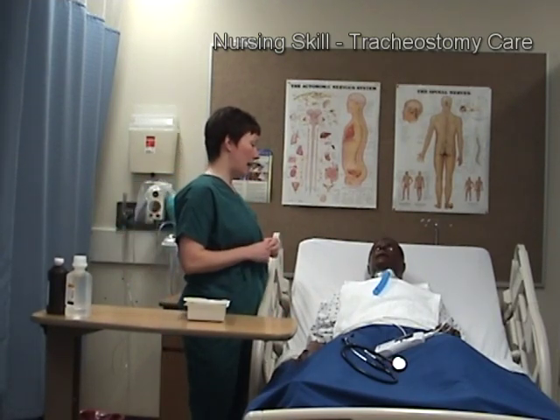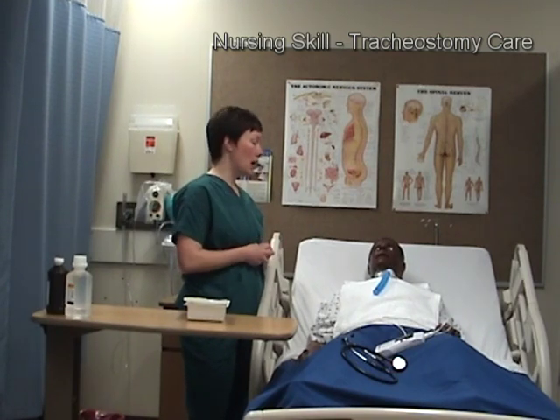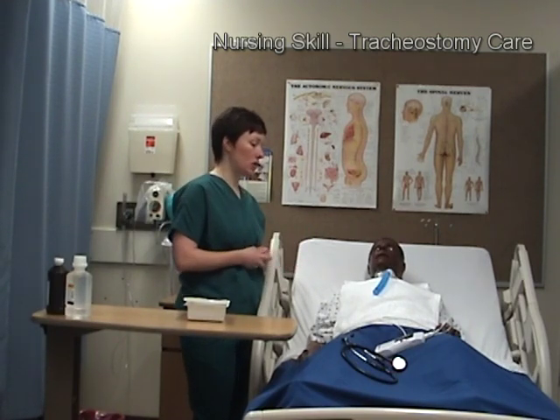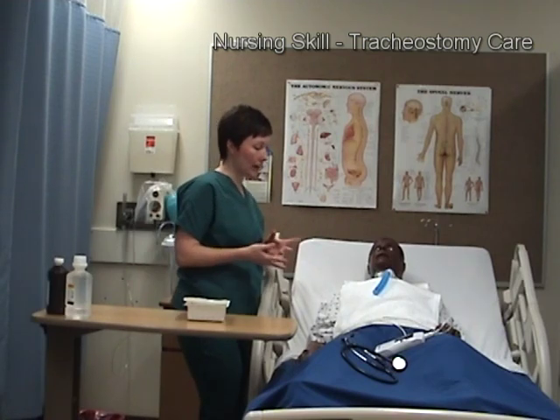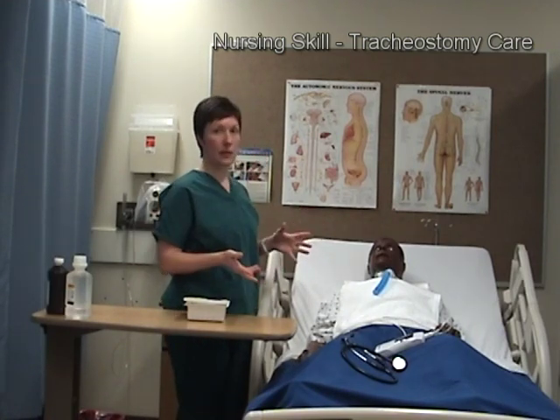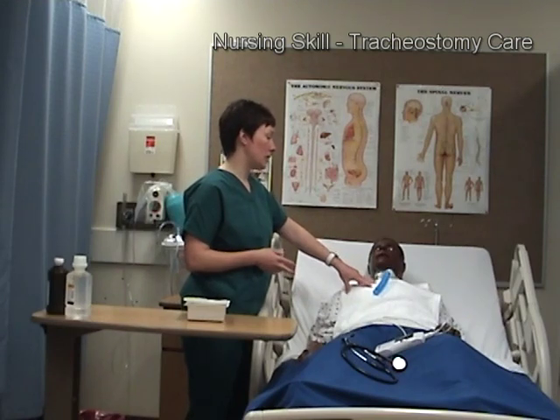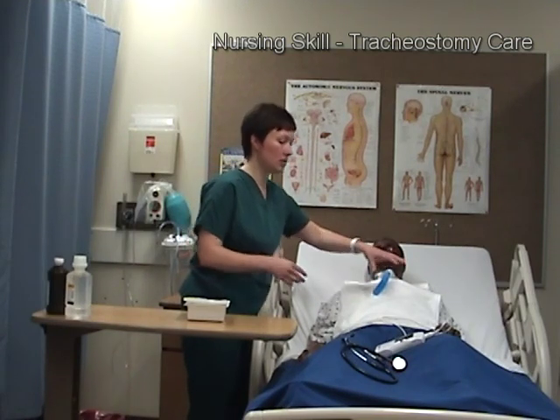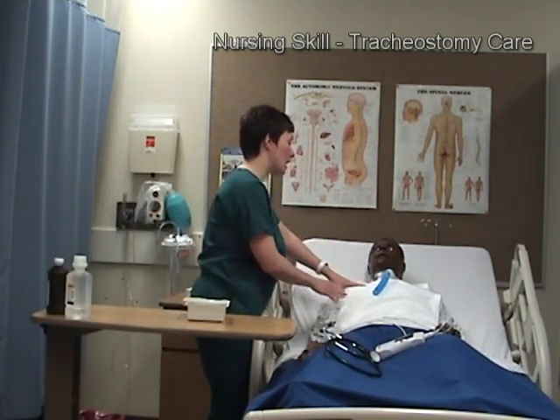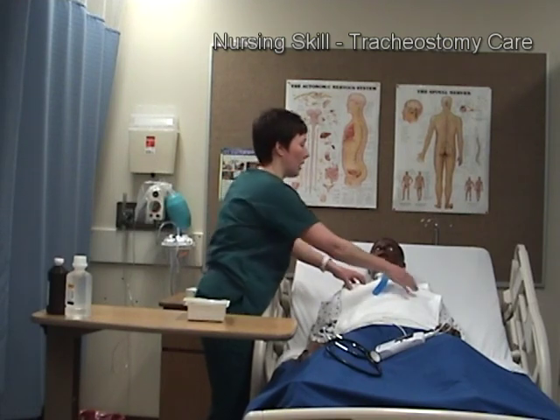I will have wanted to provide patient privacy and introduce myself to the patient. At this time, I'm going to get a baseline set of vitals on the patient, assess any respiratory distress, listen to the patient's lung sounds, and check for any presence of crepitus.